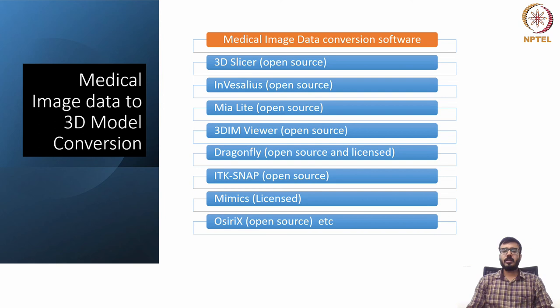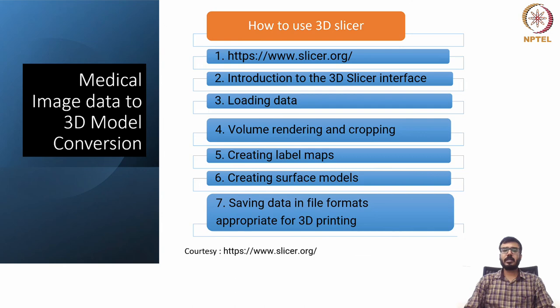For this particular session we will see how medical image data can be converted to 3D models using the software 3D Slicer. First, we need to download this 3D Slicer software from the parent website slicer.org. There are different steps involved in this process of converting medical image data to 3D modeling, and we will see them one by one.